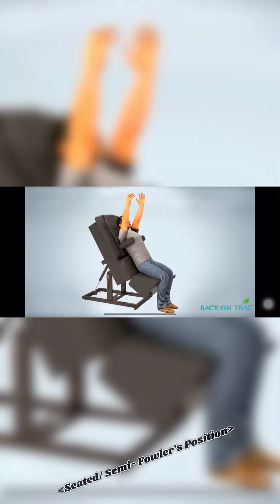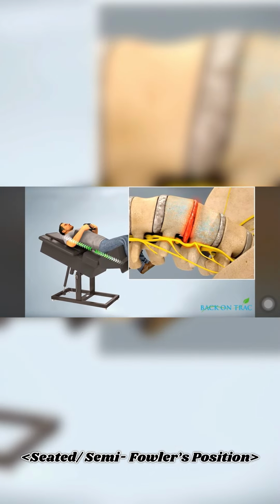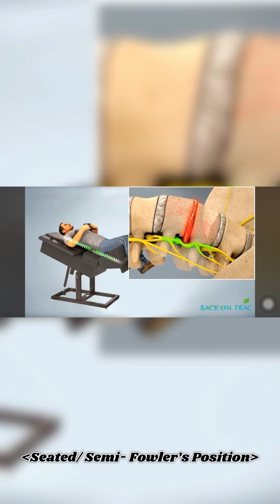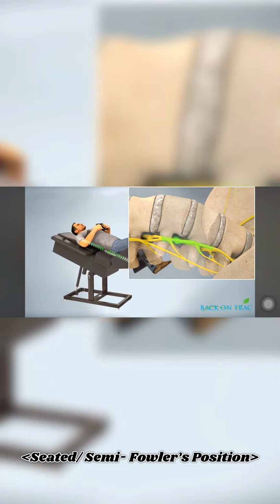Now comes the third one, that is sitting or semi-Fowler's position. The patient has to be reclined at 30 to 45 degrees and the knee is supposed to be bent. This is less frequently used because it's a little inconvenient and it gets a little difficult to manage patients in this, and plus the traction force doesn't come as much. But it can be given to patients who cannot tolerate supine and prone. I mean, if there's no other option, then you can do this.